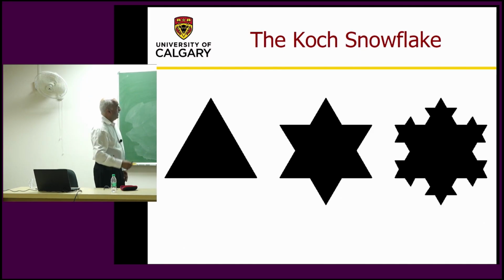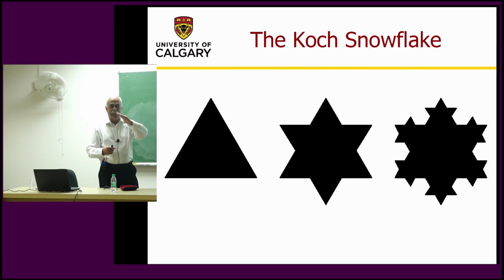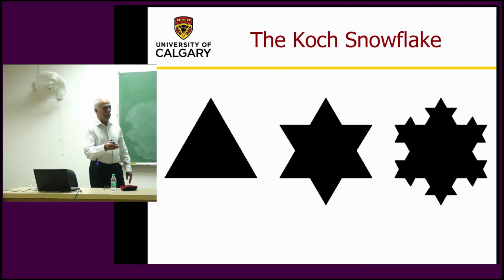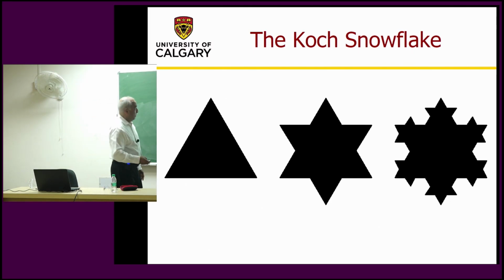So I tried to make 2-dimensional patterns similar to that, but on a grid in a graphics tool. So some of these are not perfect because I can't make lines at all angles. So angle placement I encountered some limitations in the very simple TGIF graphics tool that I used. You may have better tools and you may get a better result here.